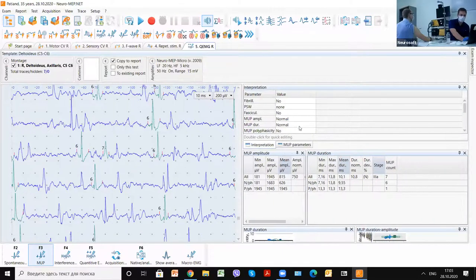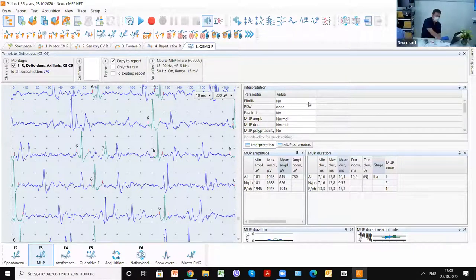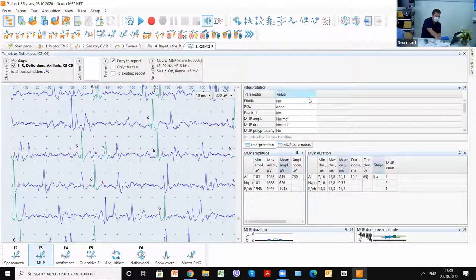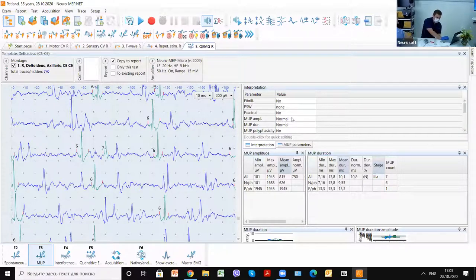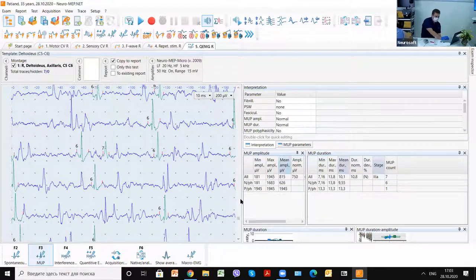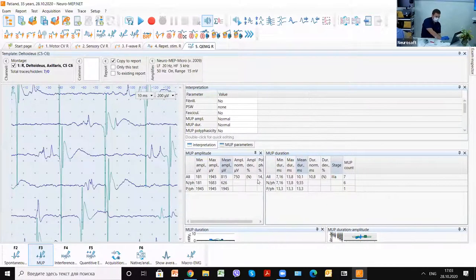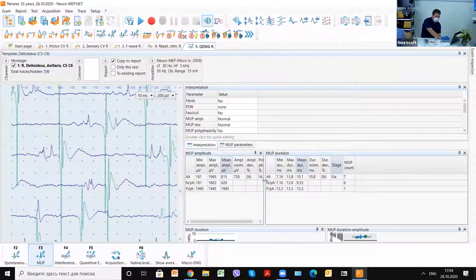We can see and choose here: no denervation activities, normal motor unit potential amplitude, motor unit potential duration.